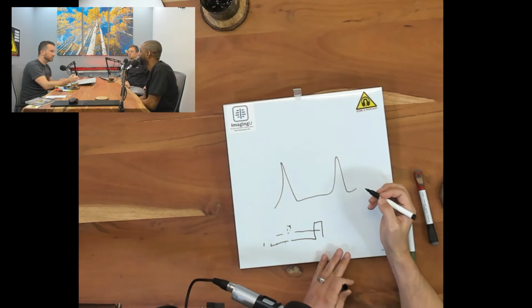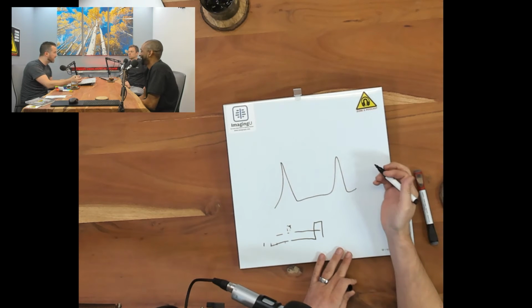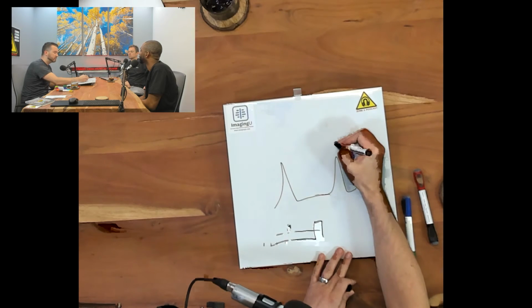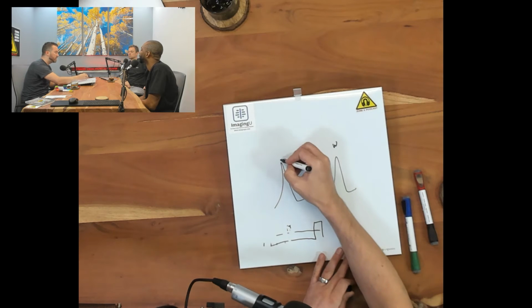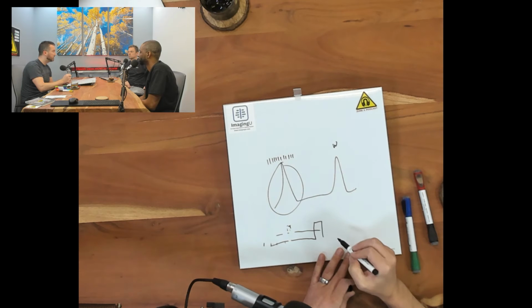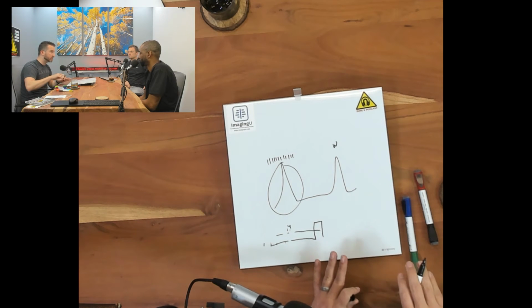The thing about a STIR is that it's going to affect all tissues. Whereas a spectral fat sat is only going to affect one peak. When I say spectral fat sat, we've all seen this: we see fat and water, and depending on the vendor, you might have these backwards. In this case, if this is water, we put a certain range of frequencies into the patient to excite just fat. We put it into the transverse plane, and we turn on a gradient to dephase it. It's called a crusher gradient.